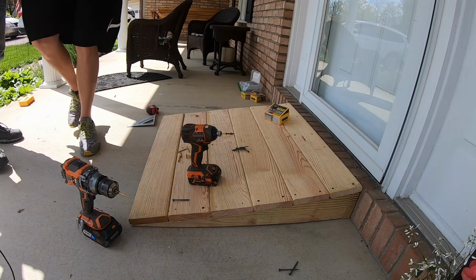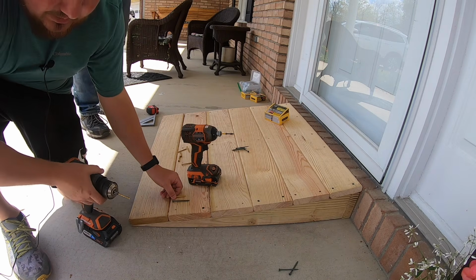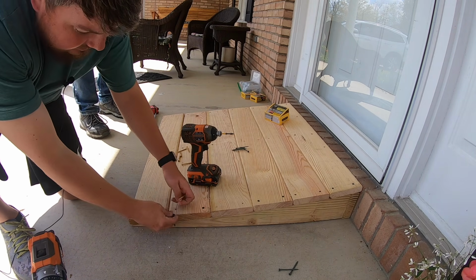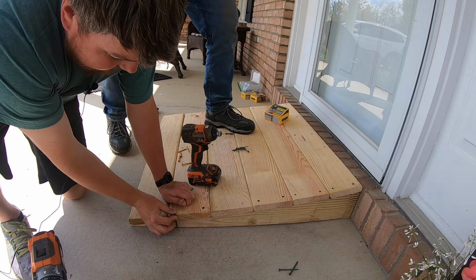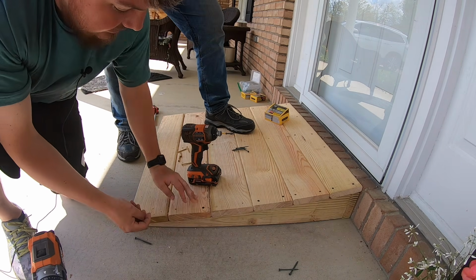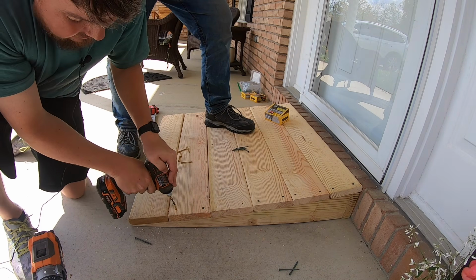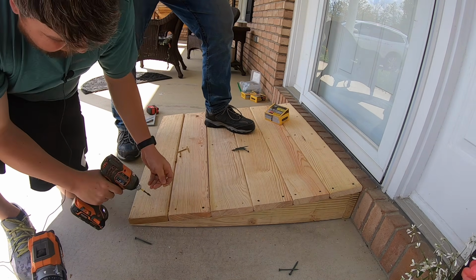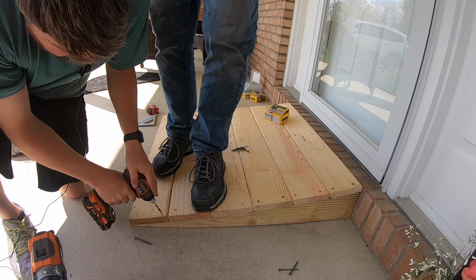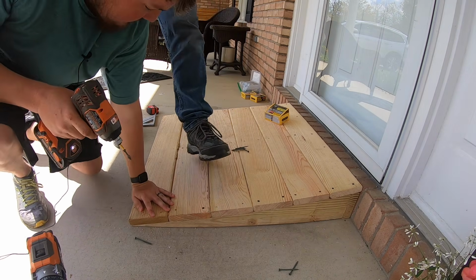Yeah. So if you end up raising up the board like we did on that, you are going to need a smaller screw. And the closer you get in, the more of an angle you're going to have to go. Because if you can see, you're going to hit the ground right there. But you may need to go ahead and put it at a little bit of an angle as well. And that will help you out a lot there. And especially for this last one, you really want to make sure you're at a really good angle. And you can hear I just started to hit the ground, but that's fine.